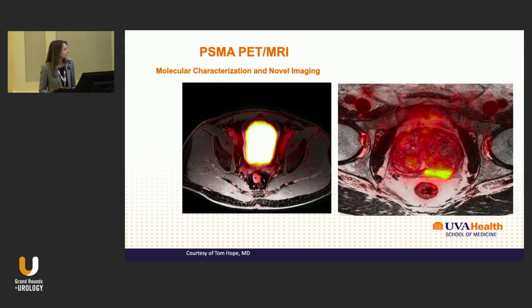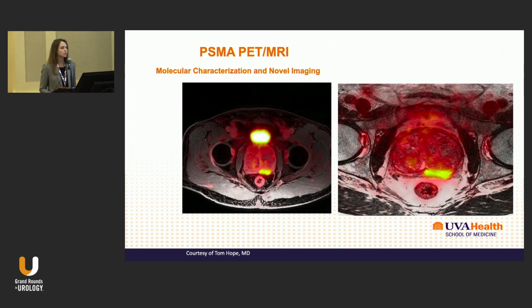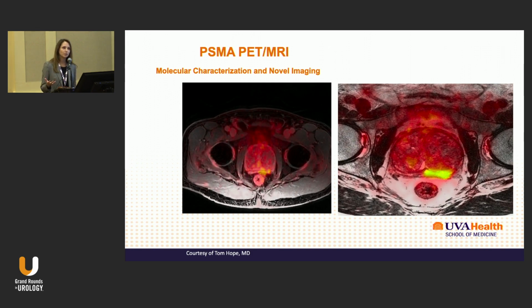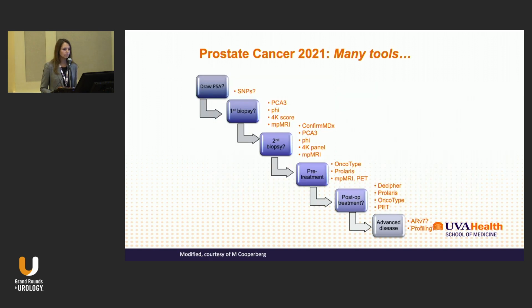What I think is fascinating in this as well, certainly this patient is metastatic, but you can see the index lesion within the prostate on PSMA PET-MR, which is interesting to think about focal therapy in the future and the use of this technology in that regard.